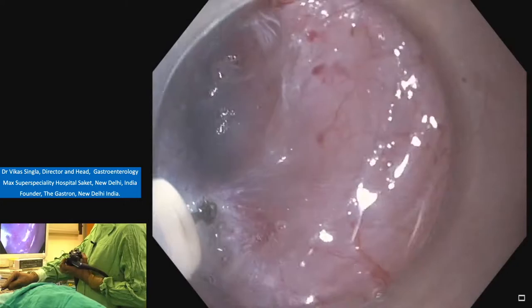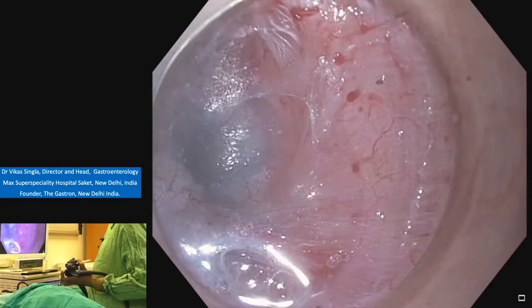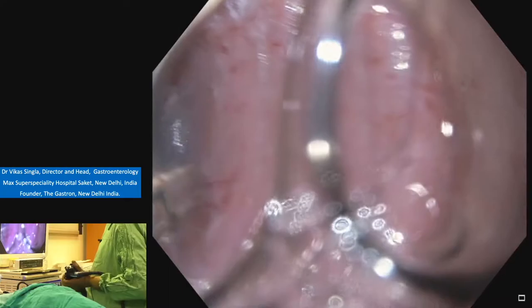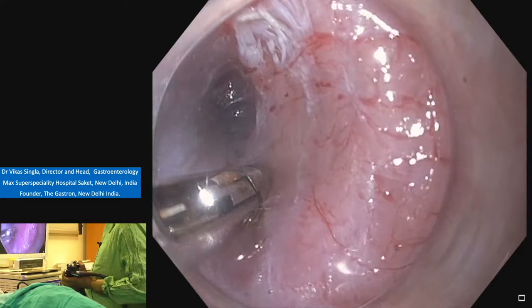Use a coagulator again to prevent the bleed. Again, the same step. Open. Grab the vessel and then coagulate.